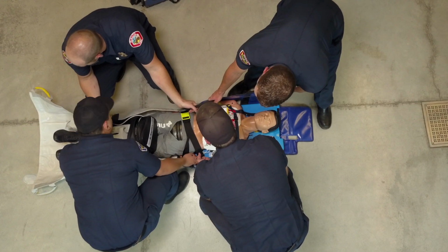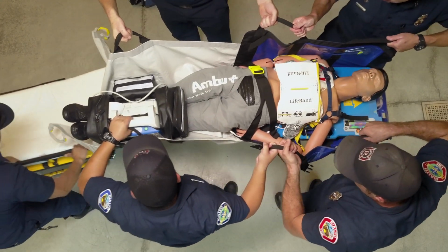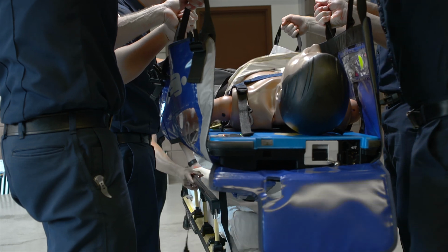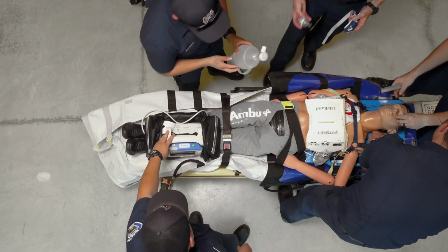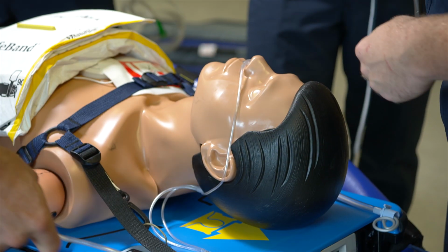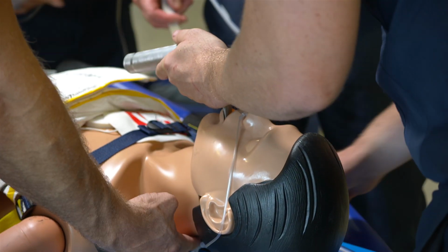We set our AutoPulses up so that they do continuous compressions regardless of the airway that we're utilizing. We place a patient on a gurney right after we place them on the AutoPulse, and we use the gurney as a tool for intubation. Much like they do in an OR or in an ED, we'll place a patient on the nasal cannula at 15 liters, and when our medics are intubating, they have all the time in the world to intubate.